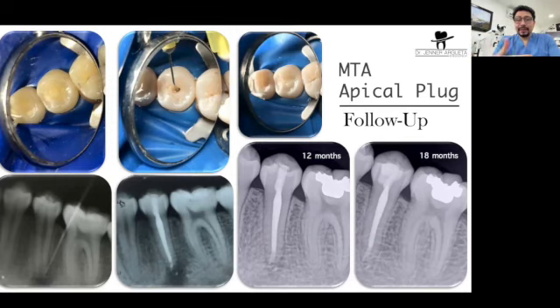But nowadays, if I have to do a similar treatment, I will finish that in an hour and a half, maybe, or maybe in 1 hour, feeling relaxed. Because I have a good visibility, I can be relaxed, I can have a better understanding of my clinical working area, and the microscope for sure will help. And the clinical practitioners can do a lot of treatments without the help of magnification, but forcing the eyes, generating stress, not being so precise. And definitely there are some treatments that cannot be performed without the help of magnification, or they can do it, but the success rate will be lower.